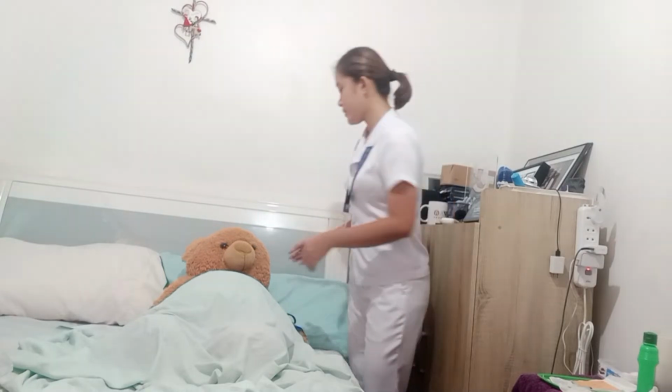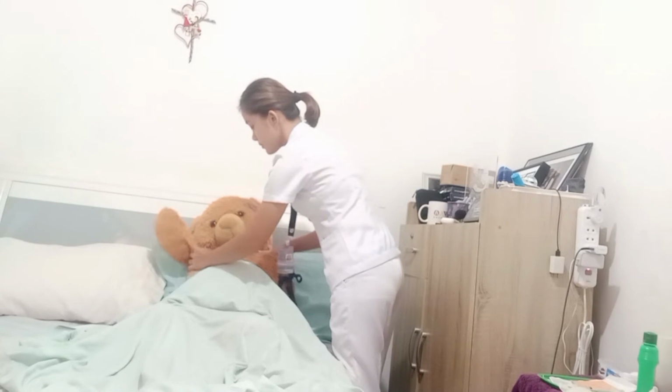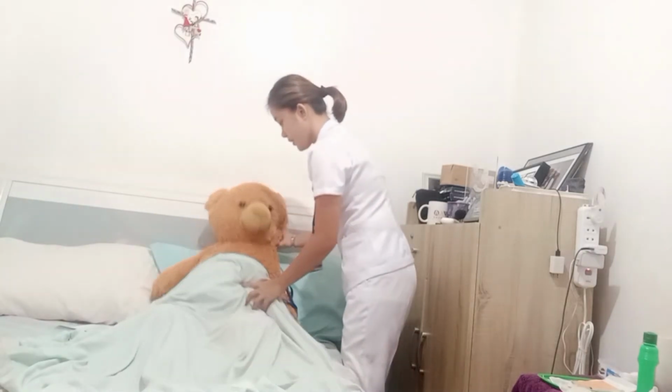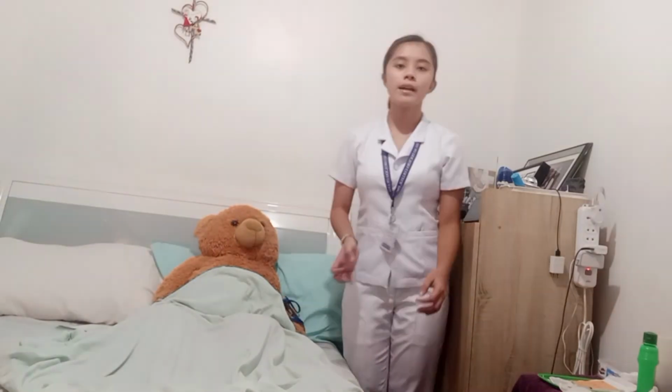So now place the patient in a comfortable position and ask the patient to relax the area you are about to inject. So ma'am, can you please sit down? Okay, please relax your arms now. Now I have to apply clean gloves and clean the site with an antiseptic swab in a circular motion starting from the center outward.